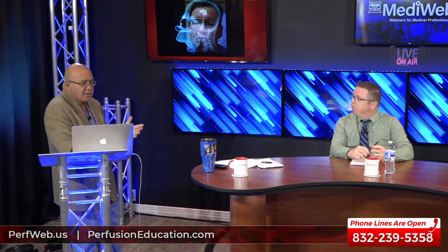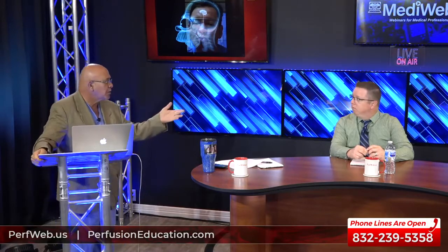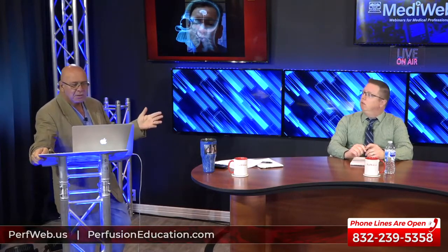So let me ask you this. When the surgeon says to you, come down on your flow, he's going to put the clamp on. Right. Come down on your flow. What do you do? Generally, I partially clamp the line. Okay. There are times when hands are busy, I'm doing other things, because it always happens when I'm doing other things, whether it's coming on, clamp off. Mm-hmm. So there are times when I clamp the whole line. Mm-hmm. But generally I try, and I've actually changed now lately to trying to bring the pump flows down as well. Mm-hmm.